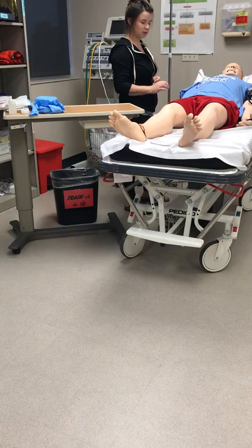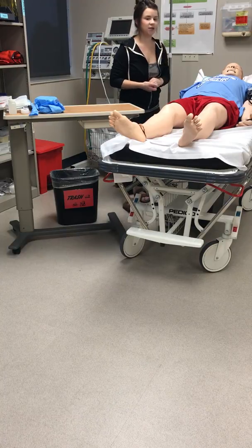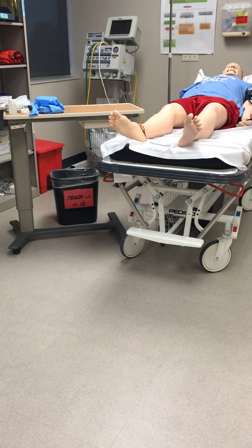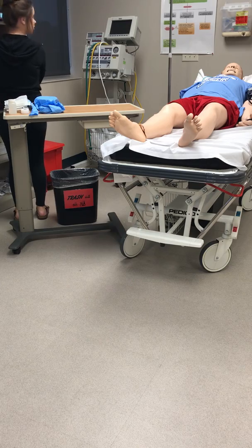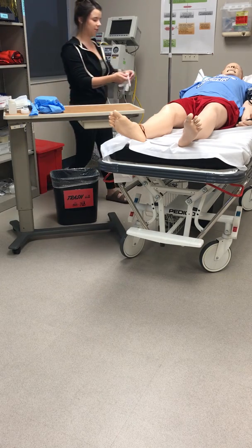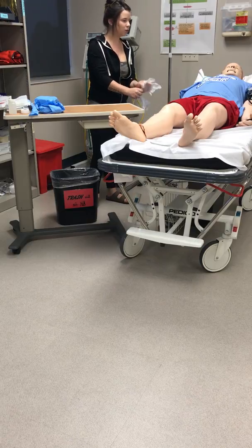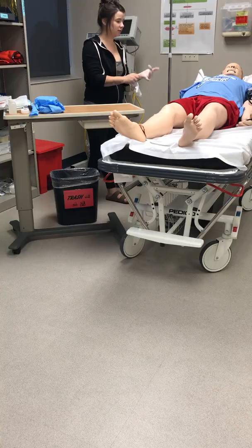Great, that matches up with what's on your wristband. And any allergies? Okay, perfect. So I'm going to go ahead and wash my hands with soap and water and get some gloves on. Okay, and so I was in here about 30 minutes ago and gave you some pain medicine. Since your pain was at about a 9, what would you rate your pain at now? Okay, perfect. And is that manageable then?